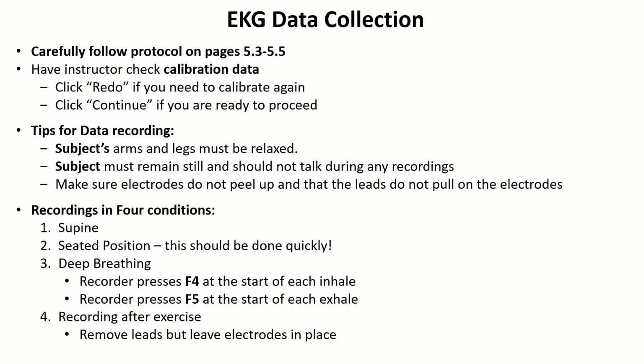Just a few tips for data recording. Make sure the subject's arms and legs are relaxed as they take their data. Any movement that they generate will actually throw off the tracing recordings within the software program. Again, this requires them to remain still, and it also means they shouldn't be talking at all. Make sure the electrodes don't peel up and the leads don't pull on the electrodes. This is where your assistants throughout the exercise are going to be watching at all times.